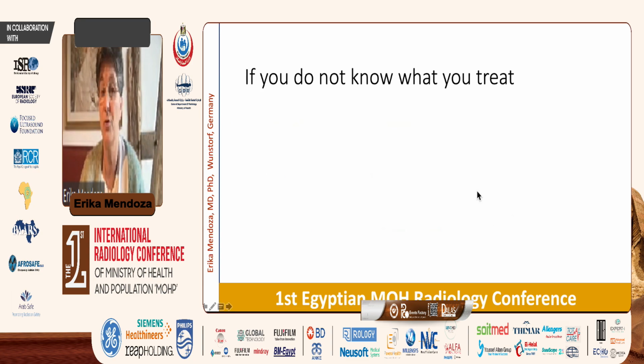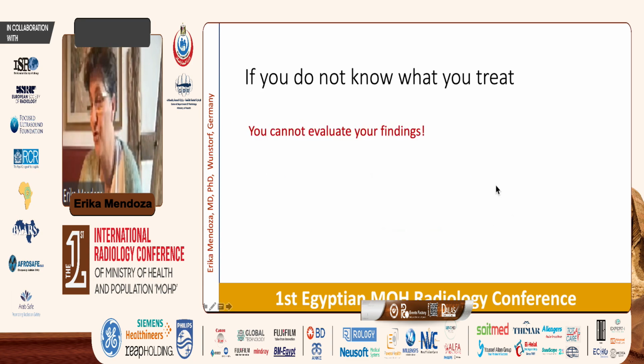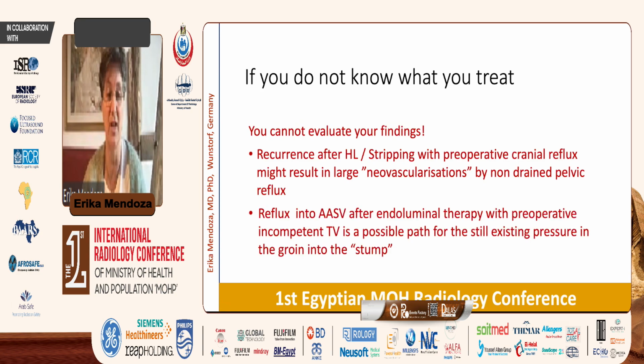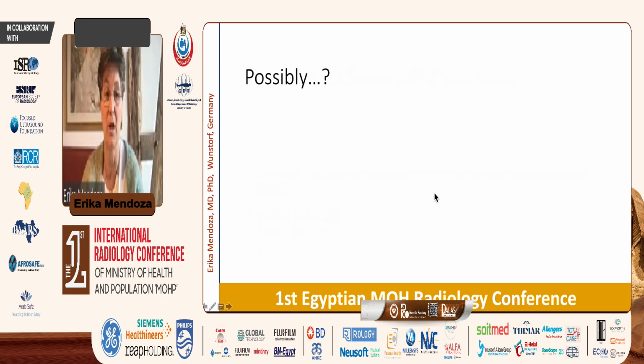If you do not know what you treat, you cannot evaluate your findings. This is what I told you in the first point. So the recurrences after high ligation and stripping with preoperative cranial reflux might result in neovascularization by non-drained pelvic reflux. And reflux into the accessory anterior vein after endovenous treatment is a possible path for the still existing pressure in the groin into the stump. So we have to consider this in future to evaluate the results of our work.